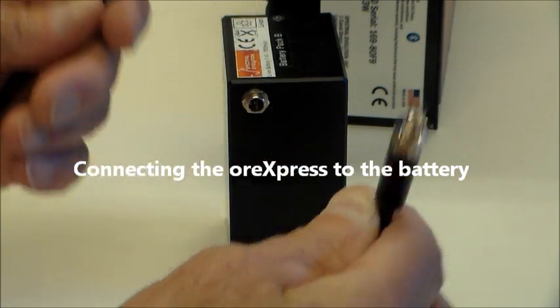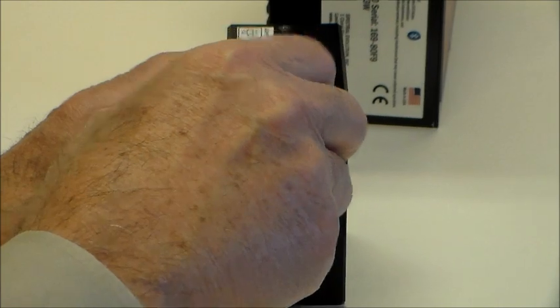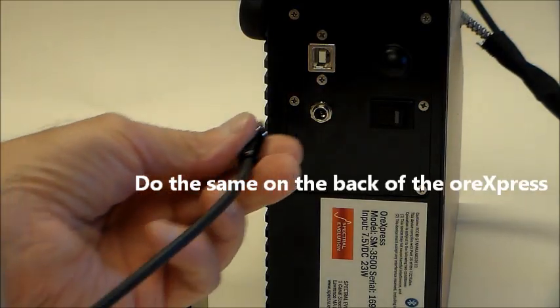Connect the battery cable to the battery, push in the connector, and tighten the locking screw. Do the same when connecting the other end to the ORExpress.